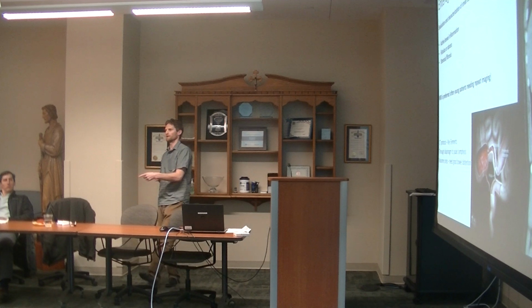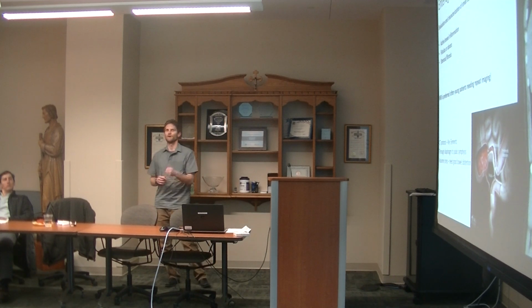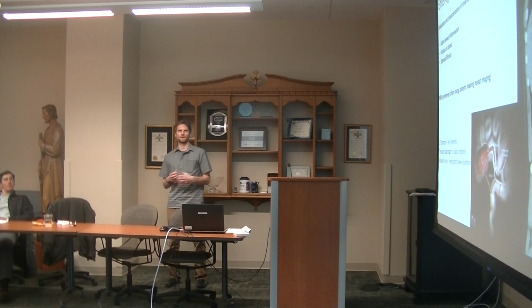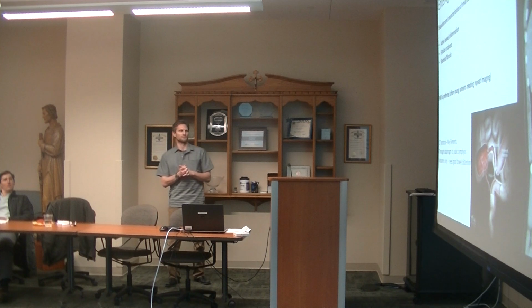This is the only protocol I think that we're using with lumen prep right now. And that is fairly critical. We do want to have the bowel well distended so that we can see the mucosa and have the bowel loops separated, looking for any significant pathology. And other than that, it's just a routine abdomen pelvis in terms of the coverage and the contrast levels.